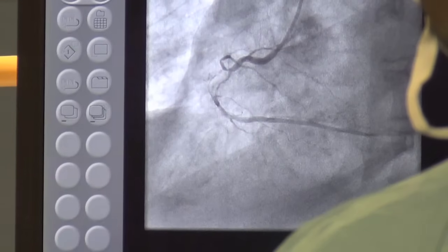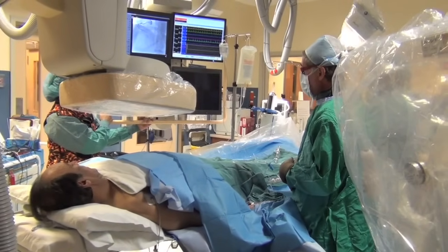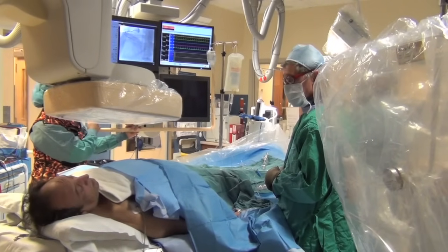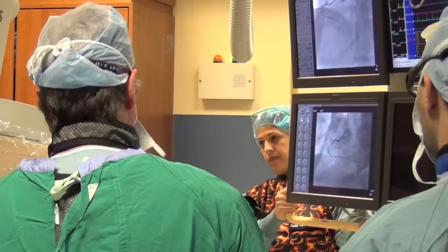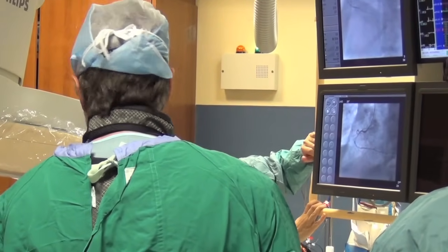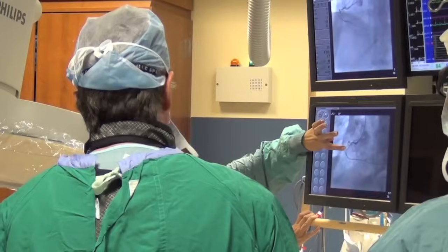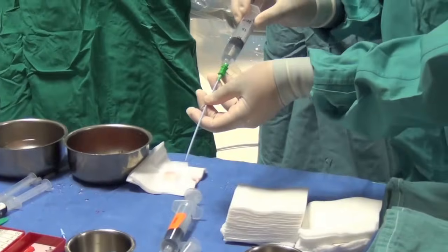If we do the angioplasty procedure either at the same time or even if you come back for it on a separate day, that takes a bit longer and depends on how complex your particular arteries and situation might be. We've completed taking the pictures and we're reviewing them now and discussing with Mr. Nazim what the best treatment option would be. In this case, we all felt that an attempt to open that narrowed artery right away would be the best treatment option.